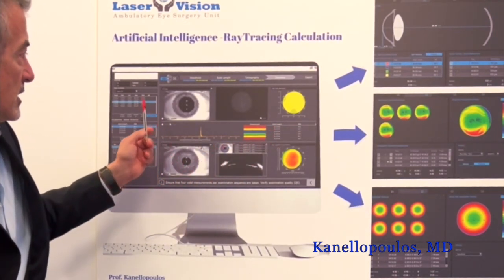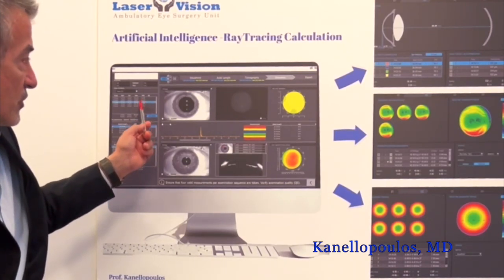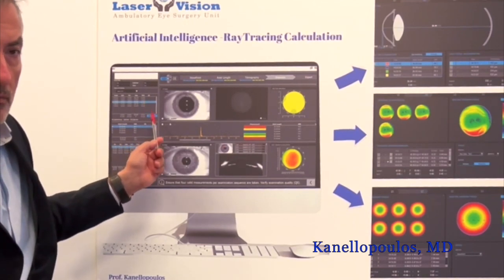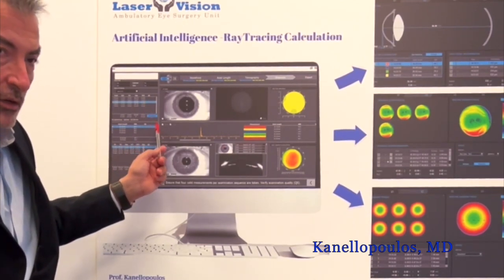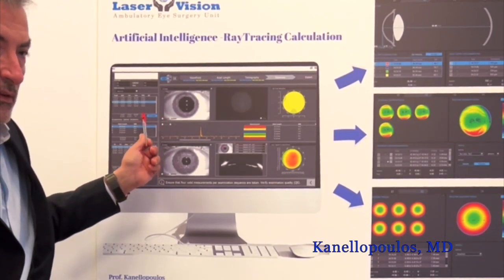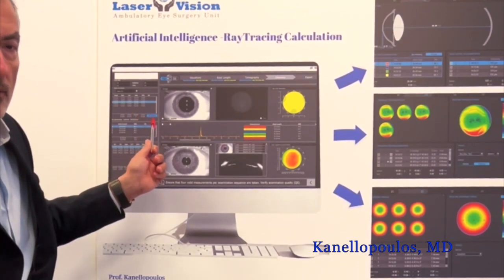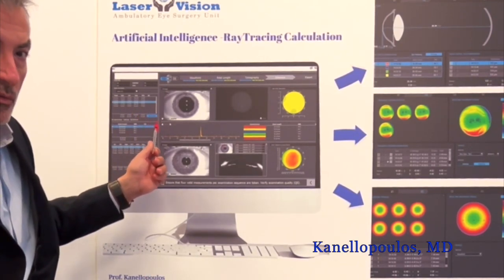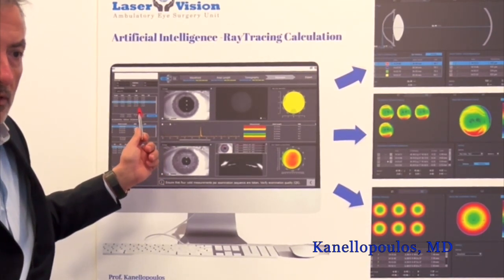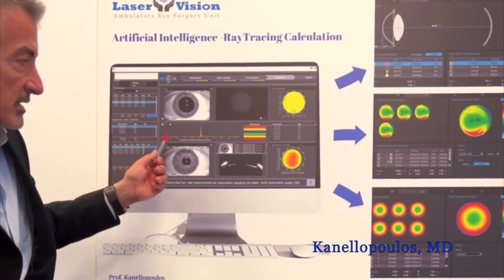And last, a Hartmann-Shack wavefront analyzer, which again takes several measurements, and these measurements need to have consistency and accuracy between them. And also, the measurement is a go if the actual refraction measured on the wavefront is within half a diopter, 1 diopter of the manifest refraction that we're measuring with the patient. So there's another element here of safety where we're trying to avoid a patient accommodating in the device.